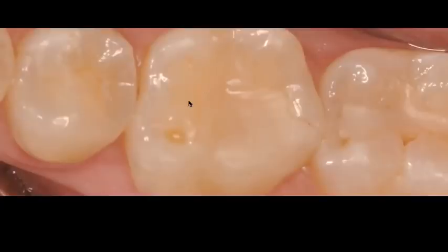You can see that maybe, I'm just guessing, when they completed this restoration, they ended up with a very flat restoration, and then they started adjusting the occlusion, and now suddenly they just removed a whole bunch of composite from the central fossa area of this tooth. Now look at the neighboring tooth. Again, a flat restoration, and this is something that I normally see when you see these flat restorations.